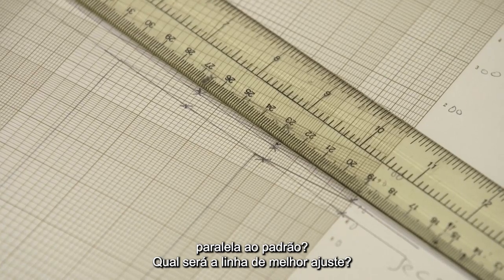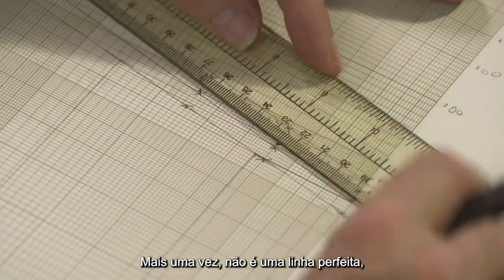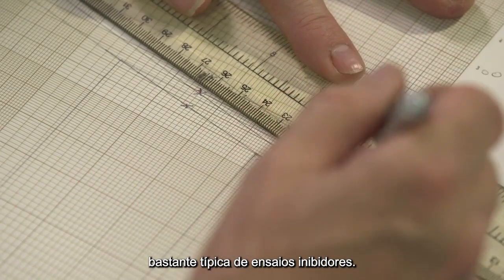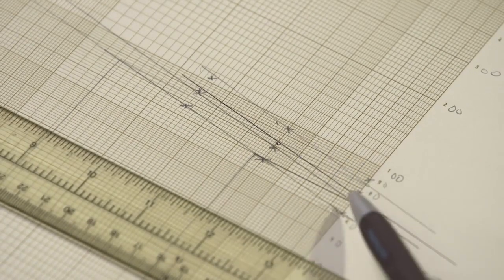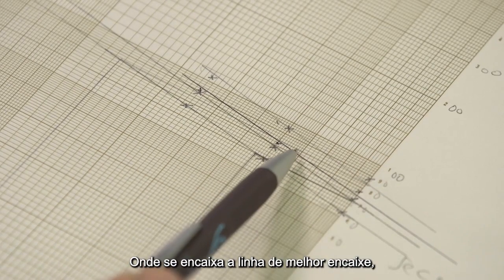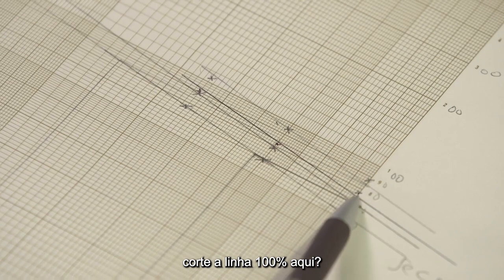So now we want to know, do we have a straight line relationship parallel to the standard? What will be the line of best fit? Once again, it's not a perfect line, fairly typical of inhibitor assays. Line of best fit, parallel to the standard. Not every point is exactly on the line. Where does the line of best fit cut the 100% line? Here.